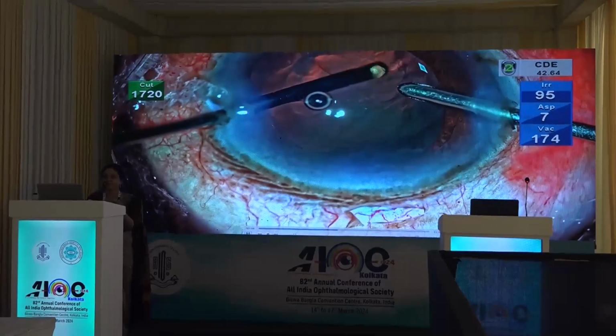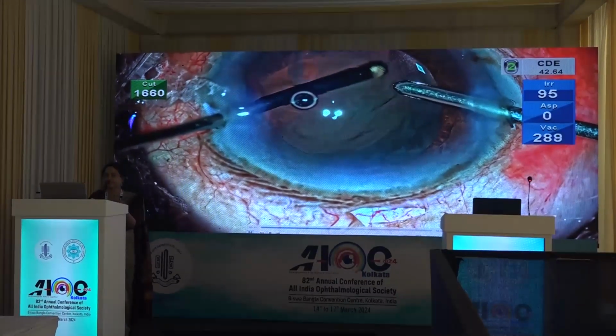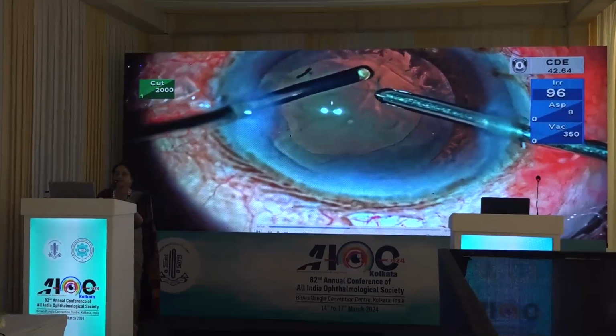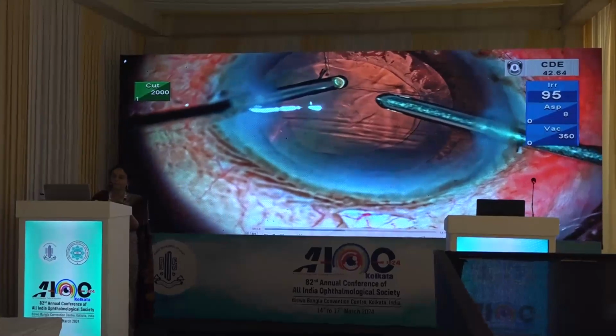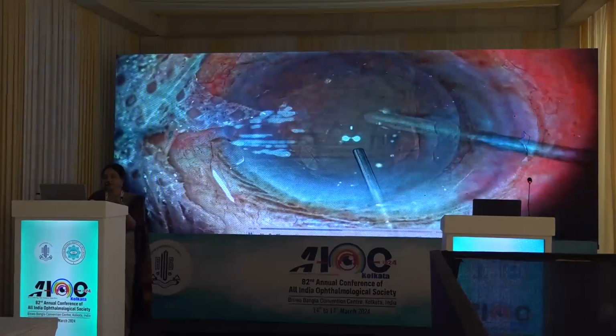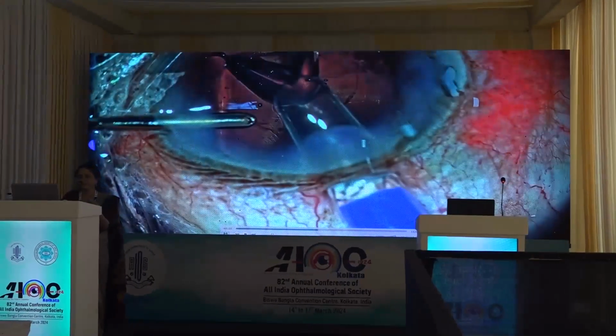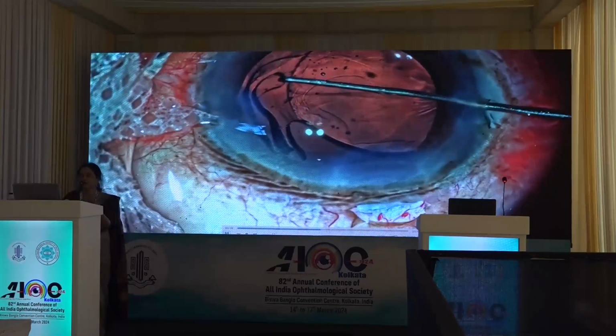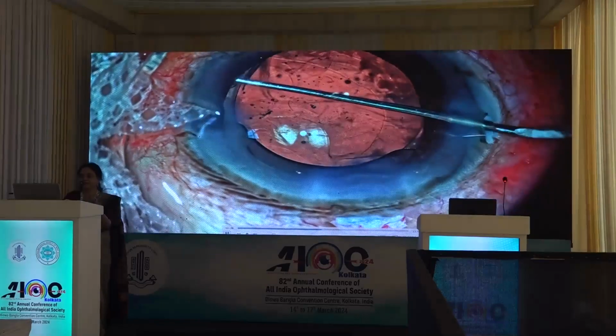Be sure that the vitreous is not there in the anterior chamber or within the bag whenever you are implanting the IOL. This is usually done by confirming using intraoperative triamcinolone acetonide diluted 1:4. Now the chosen IOL is implanted in the bag.